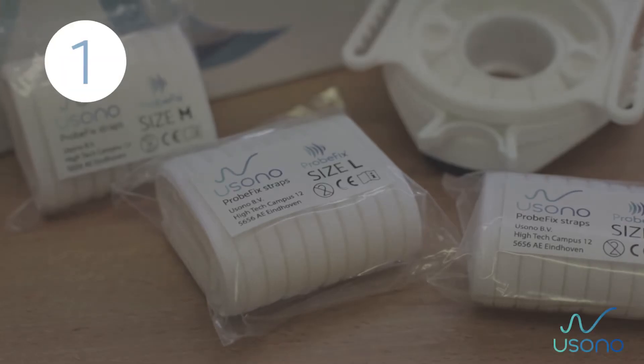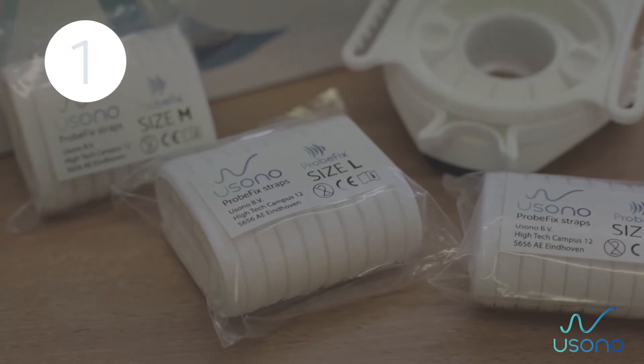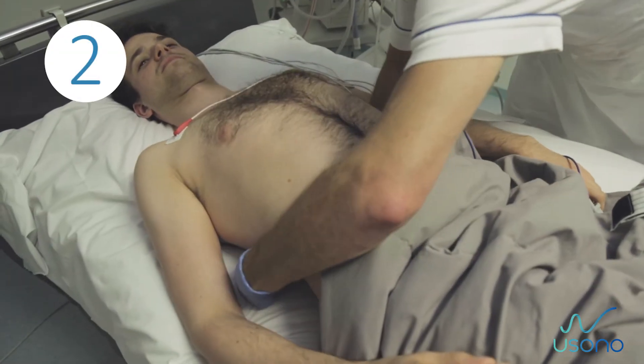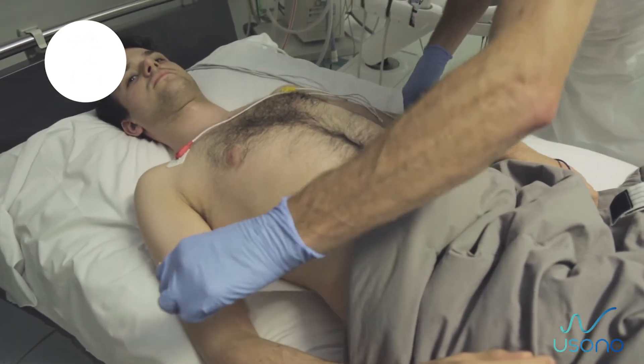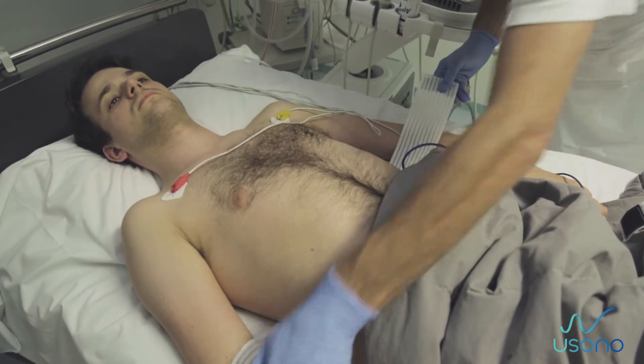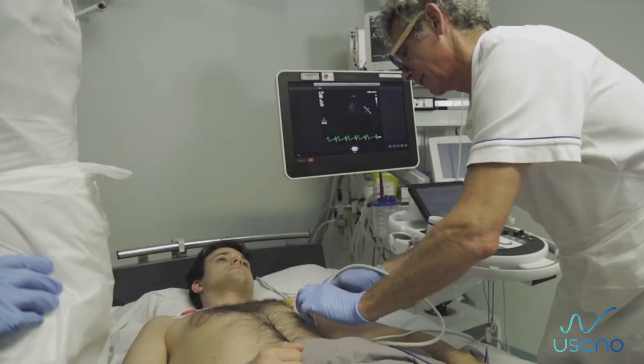Step 1: Select the right strap size according to the patient's body size. Slide the strap under the patient's back, ensuring that the velcro side is facing down towards the bed.